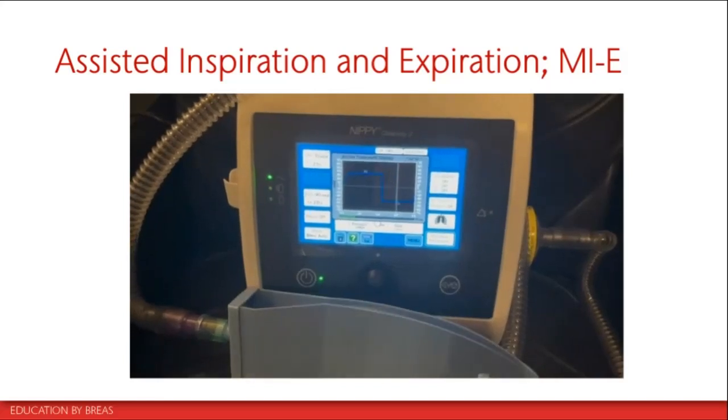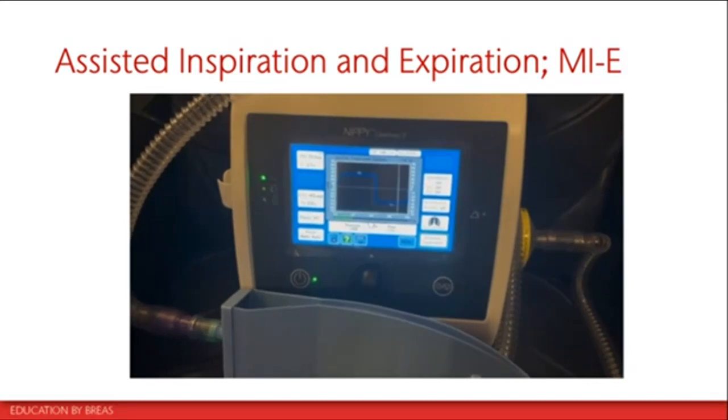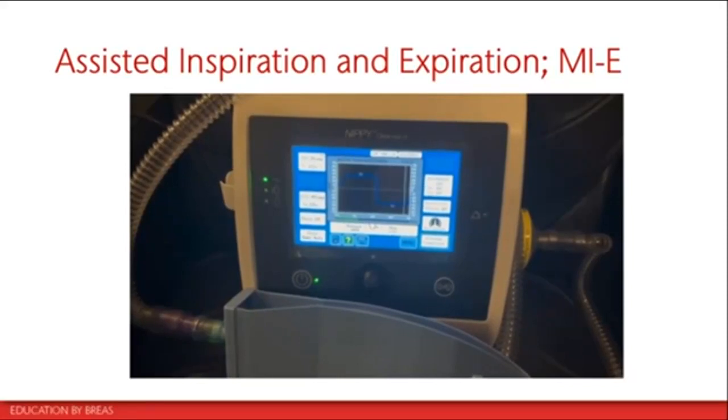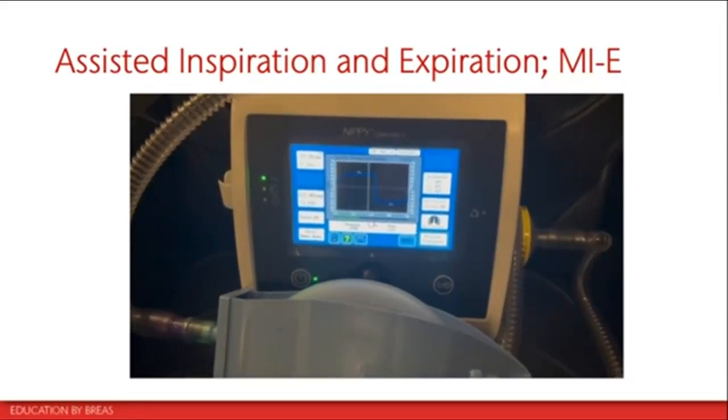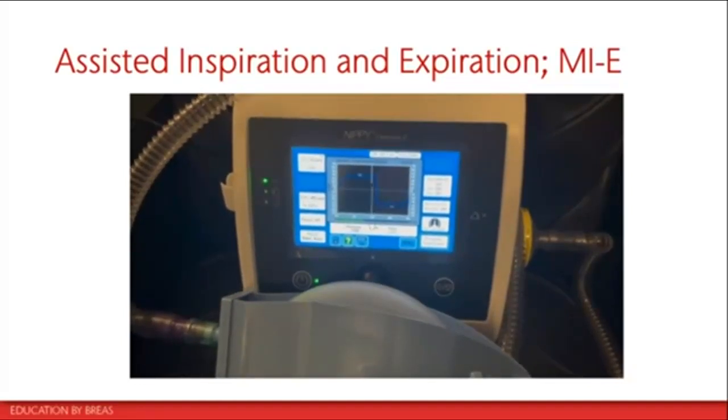This is an example of what the device does. It provides a deep breath in, and you can see the artificial lung inflated, followed by a rapid suck out, which shows the air being rapidly sucked out of the lungs or the central airways. This deep breath in followed by a rapid suck out of air helps to simulate the natural flow changes that occur with a cough, and therefore increases your cough peak flow further, hopefully improving your cough strength.